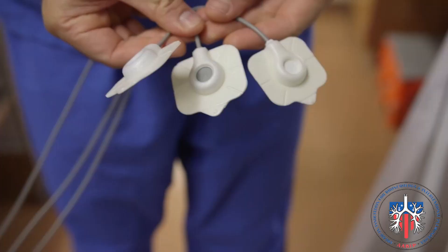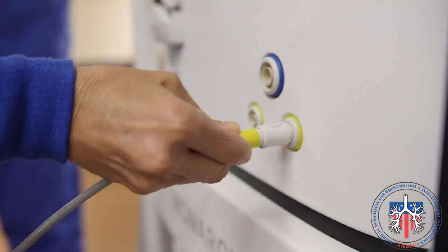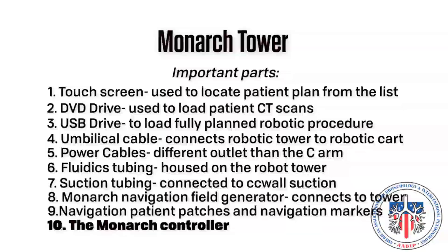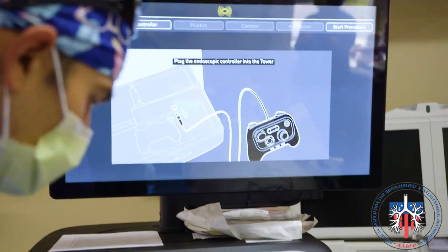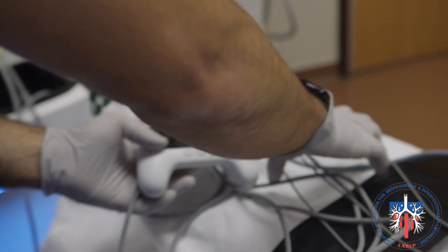The navigation patient patches and markers will contact the tower by plugging into the yellow circle as shown. Number ten: the Monarch controller. This will be used by the bronchoscopist in calibration before the procedure and to steer the robotic bronchoscope during the procedure. When not in use, it is stored in the Monarch tower drawer and is attached through this drawer.